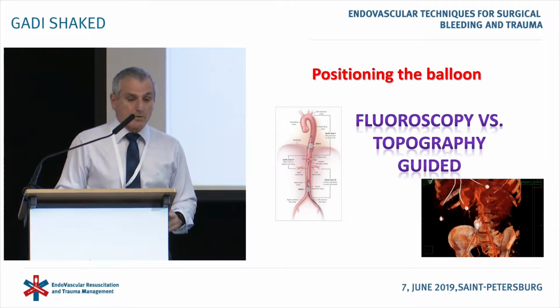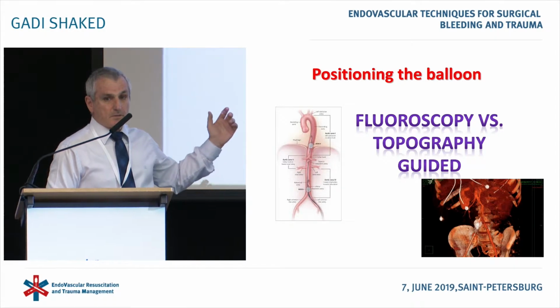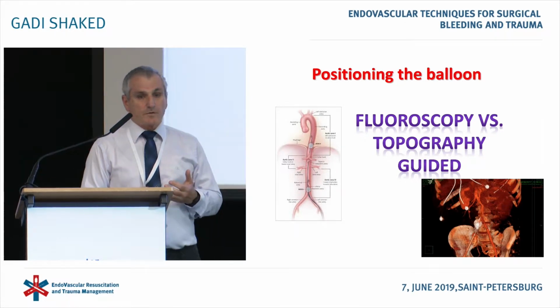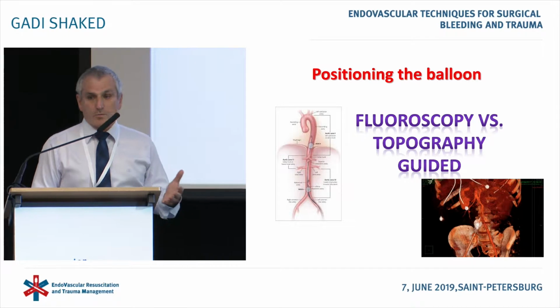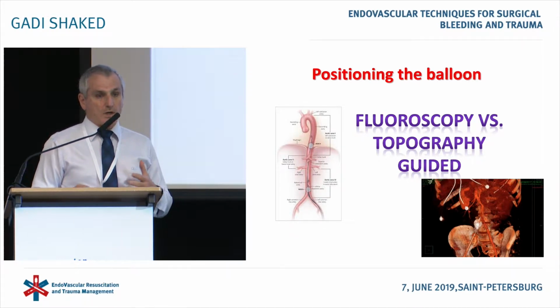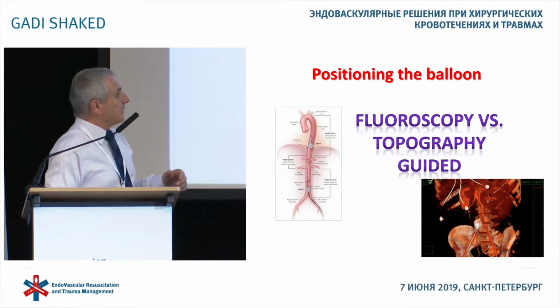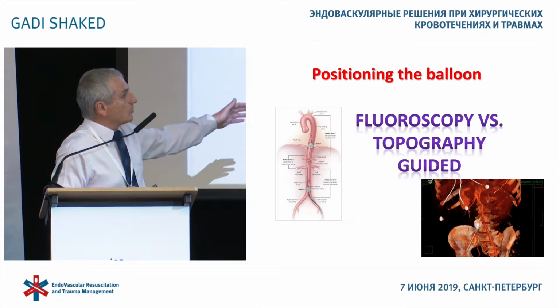Positioning of the balloon. The best is to do it under fluoroscopy guidance. But again, sometimes you don't have fluoroscopy available, or you don't want to waste too much time doing more X-rays. So on many occasions, you do it according to topography.